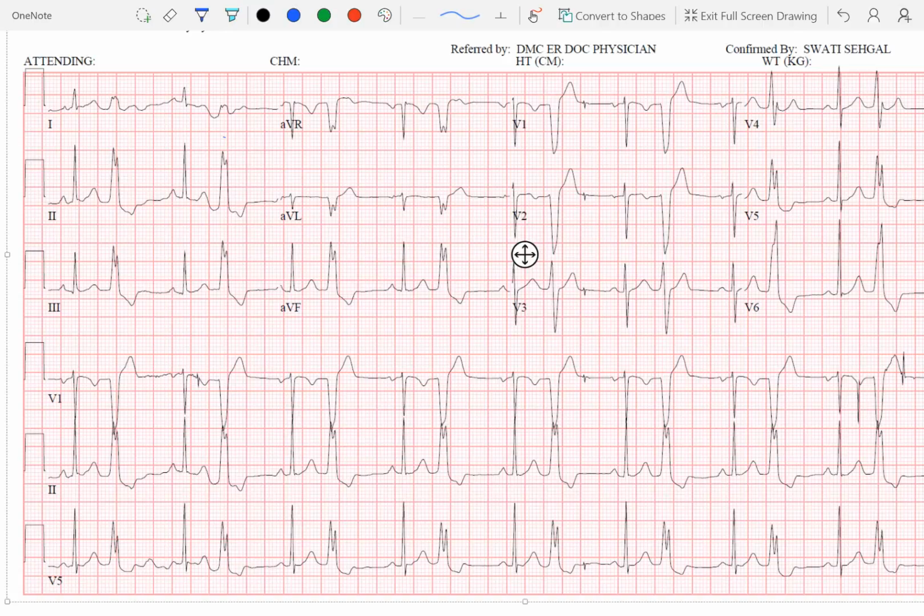And there are other things that would suggest that these PVCs are late coupled, because you look at the QRS, look at the time from the onset of the QRS of the normally conducted beat to the PVC, and you can get a sense of how closely coupled it is. In this case, I would say it's probably maybe close to 400 milliseconds. That's late coupled. It's not 300 milliseconds or less, which would suggest it's early coupled, and there is no R on T phenomenon. It's coming completely after the T wave.